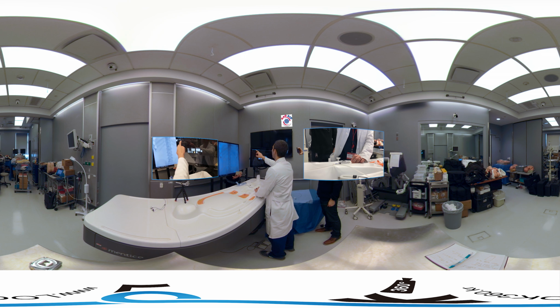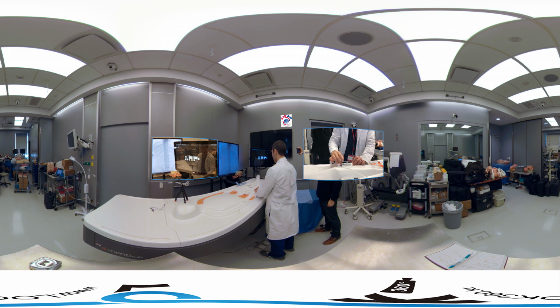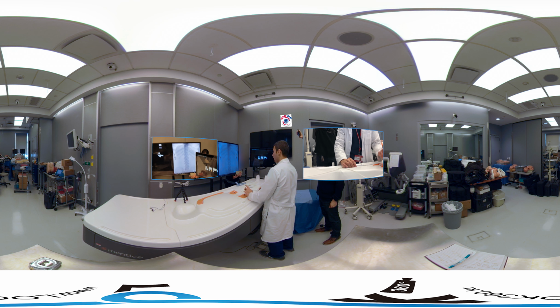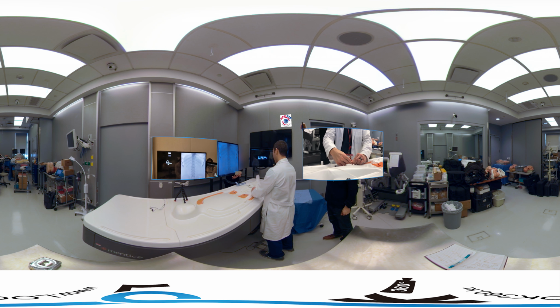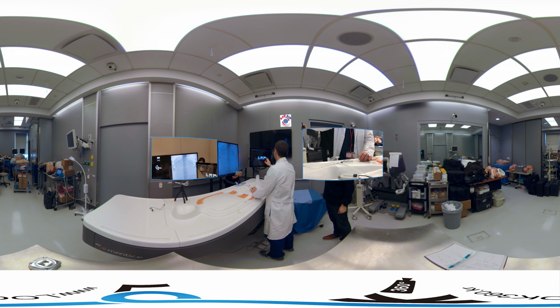And on our machine, we're going to select the filter now. What we'll also want to do is get the sheath up to the level of the renal vein. So before we load it, we can get a wire back in.